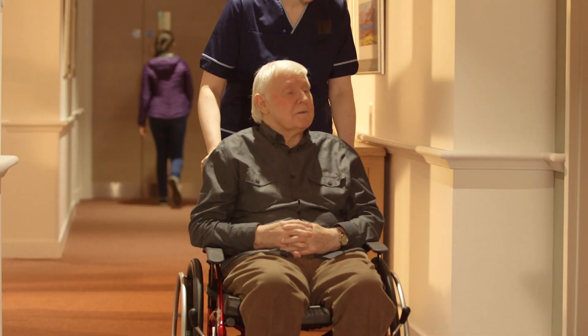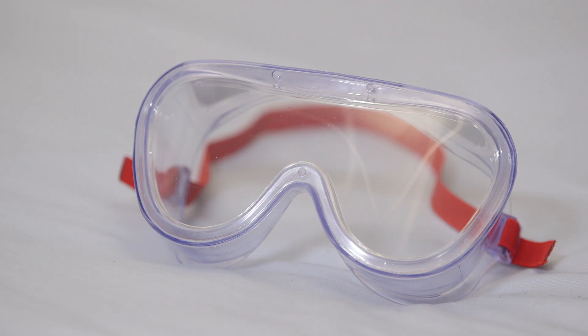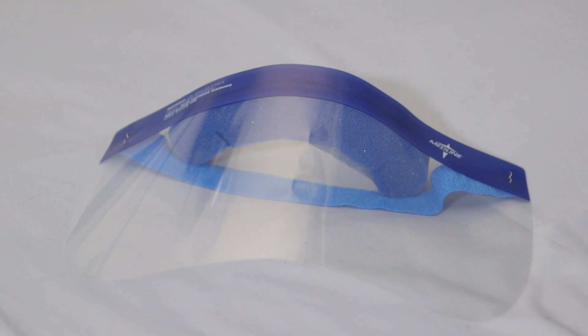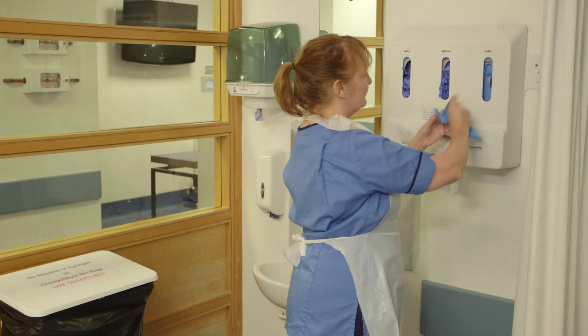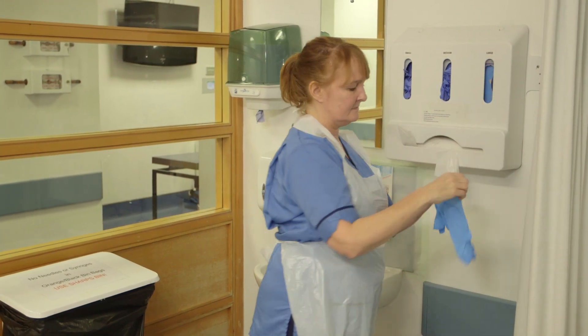PPE can comprise gloves, aprons, and eye or face protection, including full face visors. Disposable gloves and aprons are the most common items of PPE.